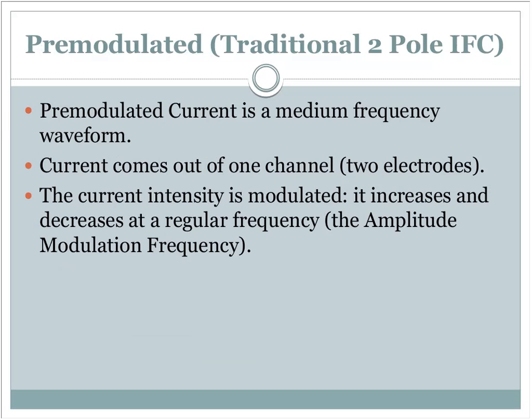So you should really never have the electrodes closer than the width of one electrode. You know, so if you're using a 2x2 electrode, you should have your electrodes at least 2 inches apart, but you can certainly go further apart than that. Pushing them further apart, you have to turn your intensity up so that the current can overcome all the resistance of all the body layers in order to get to the other electrode. So also be a little cognizant of that so you don't put it so far away that you have to turn the unit up so far that there's irritation on the surface underneath the electrodes. Okay, so this is all just a matter of balance.